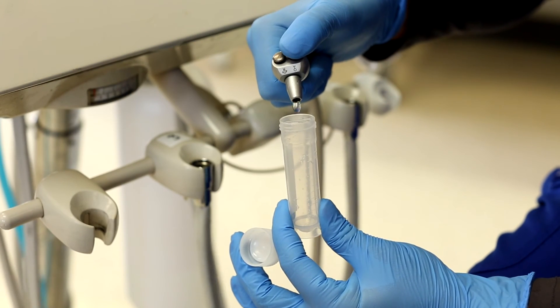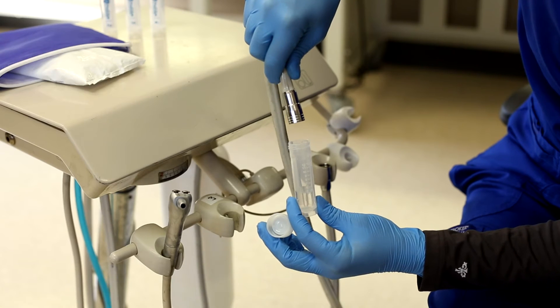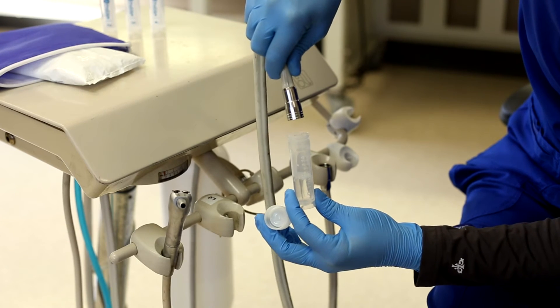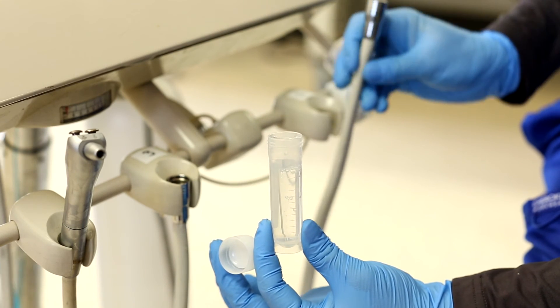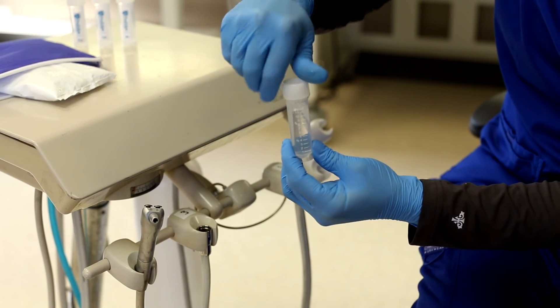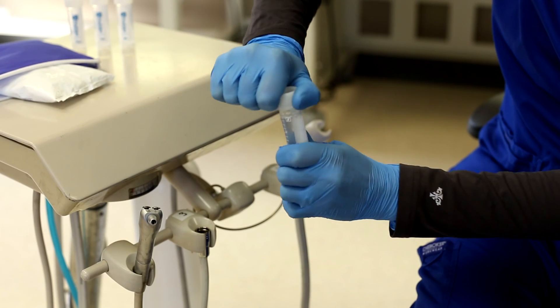All right, here I go — about one-third from the air water syringe, about one-third from this handpiece line, and finish it off with one-third from our last handpiece line. That's a pooled sample — super easy! When you get your results back, you'll see one microbial count for the entire unit you sampled.